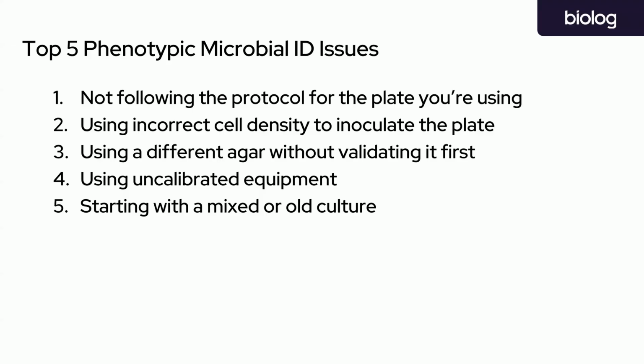Because with endpoint, you're giving them 24 hours in order to produce that pigment and potentially conflate the results. Whereas with kinetic ID, it gives a chance for the dye reduction to occur before there's significant enough pigment production. But generally speaking, the ID algorithm doesn't necessarily have to be dye reduction that the OD measurement indicates, right?